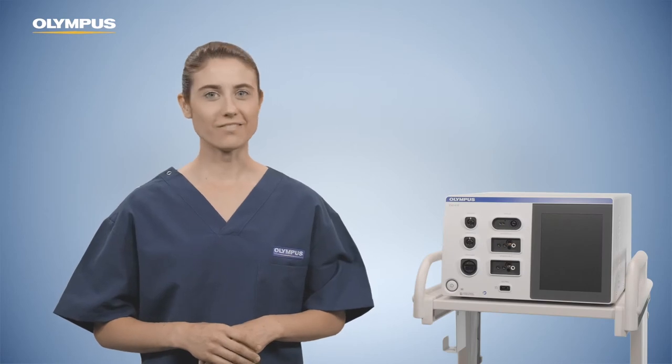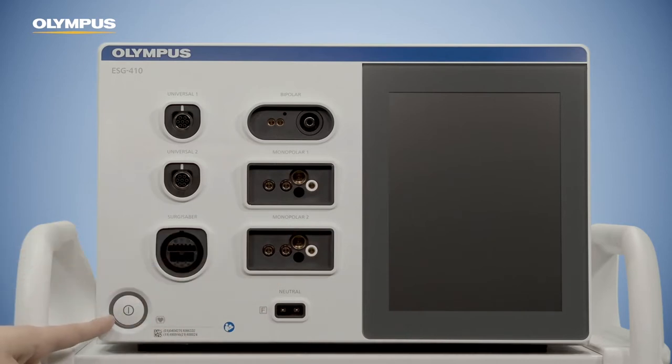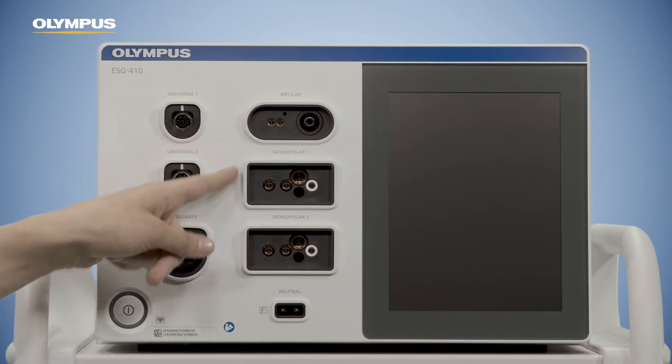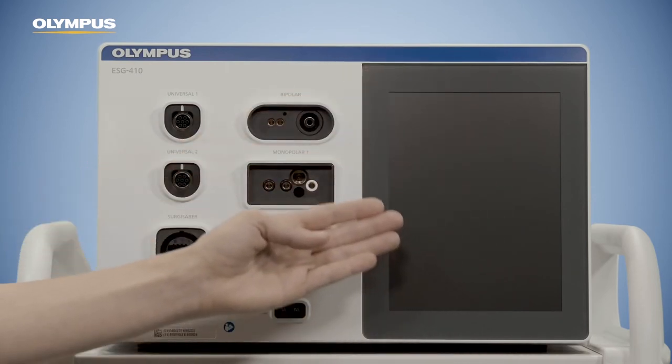The control panel of the ESG 410 is divided into two main areas. Next to the power switch, there is a connection area for connecting various instruments and neutral electrodes. The second main area is the touch screen with a graphical user interface to show and modify settings.